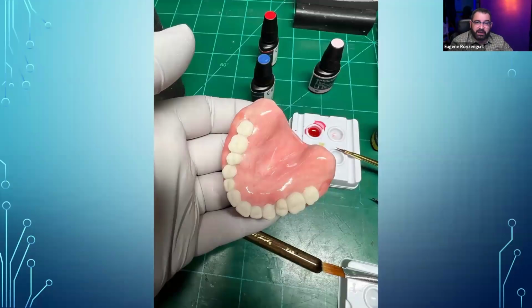Now, if you don't want to spend all that time trying to do different digital stuff, and you want something quick and dirty, ready-to-go, you can print it monolithic and then just use a mixture. What I use is OptiGlaze color. I use 2 drops of pink and 1 drop of red, mix it up, and it comes up with that color. You just cover the areas that you need to, and then you're good to go, okay?